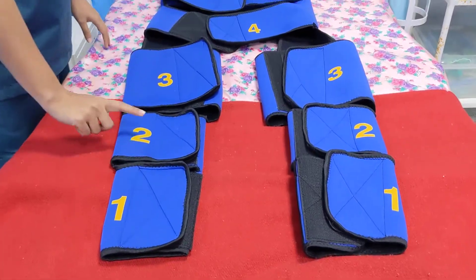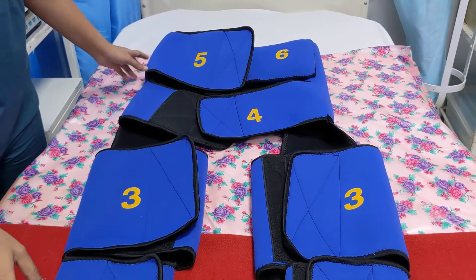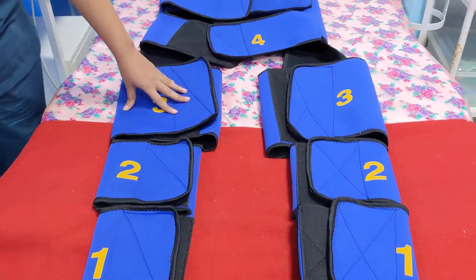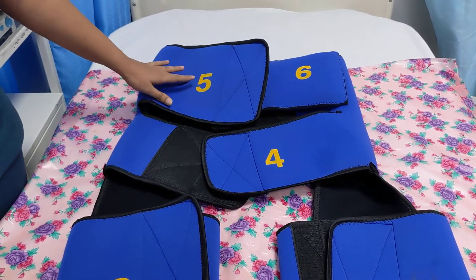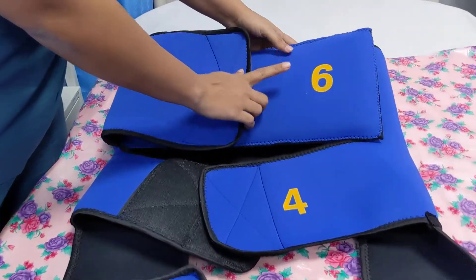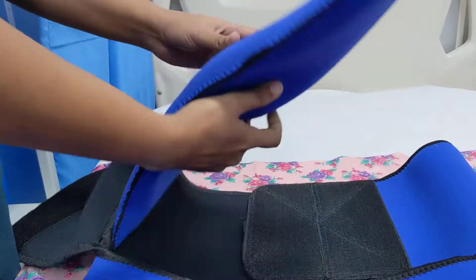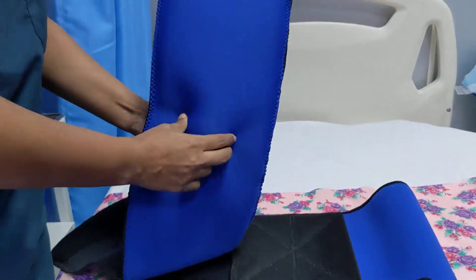As you can see, the numbered labels on the NASG — it has 6 segments. There are 3 segments each, a pair wrapped around both legs, and then another 3 segments: segment 4 wrapped around the pelvis, and segments 5 and 6 around the abdomen. Segment 6 contains a small foam compression ball within it which presses over the umbilicus.